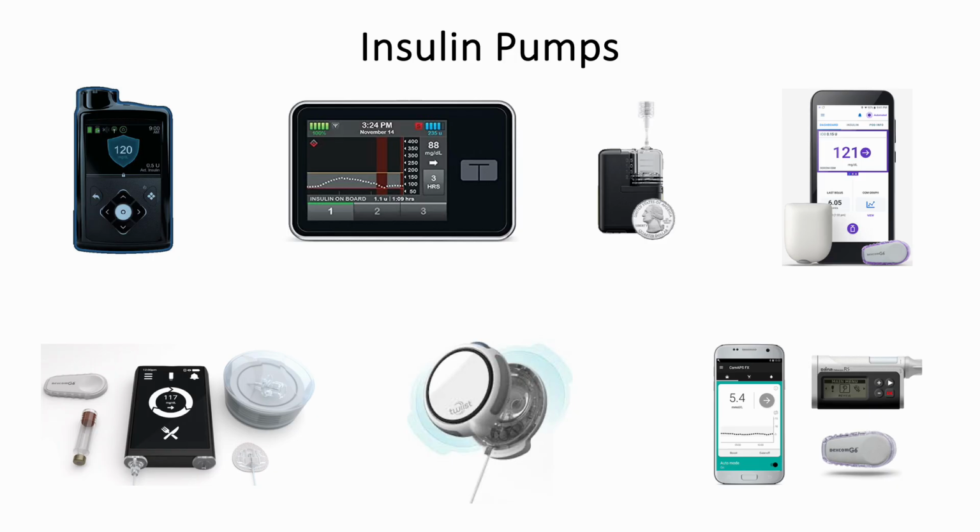The other thing I want you to be aware of is if patients are on an insulin pump, they are no longer on a basal insulin. They are not taking Lantus. They are not taking Tresiba or Toujeo. And if their insulin pump fails, or if for whatever reason you're taking their insulin pump off in the hospital, as soon as you take that insulin pump off, they now have no more functional insulin delivery, okay?